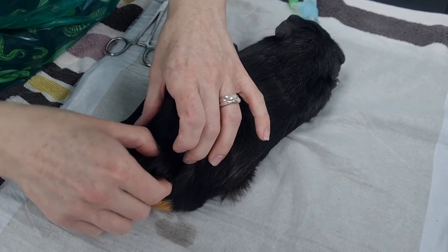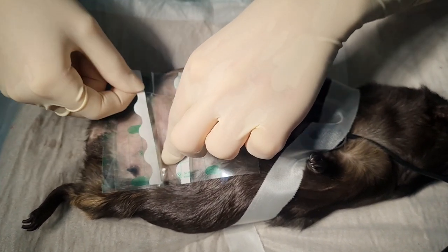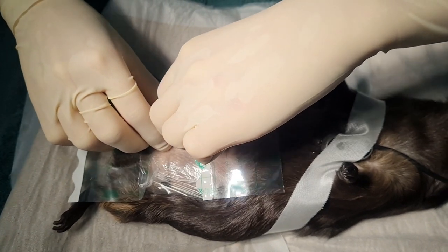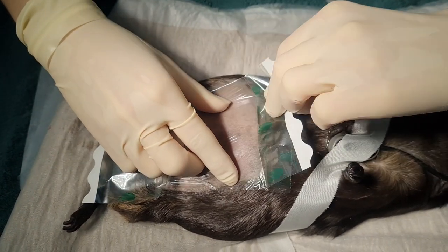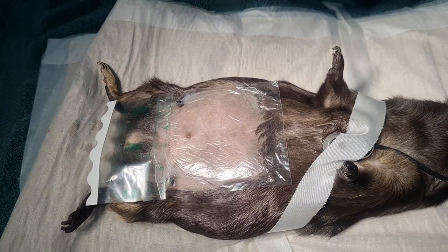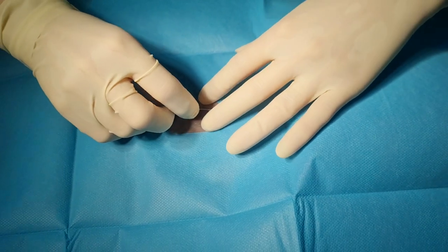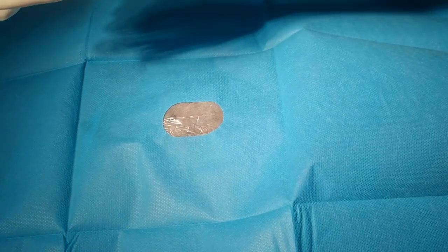We're just checking the little lump she's got because we're going to be removing that as well. Mabel is nicely asleep; she's had her fluids, meloxicam and maropitant. She's about three and a half. We're spaying her because we're suspicious of ovarian cysts — she's a recent rescue and a relatively hormonal young lady. The cysts are actually palpable on her.